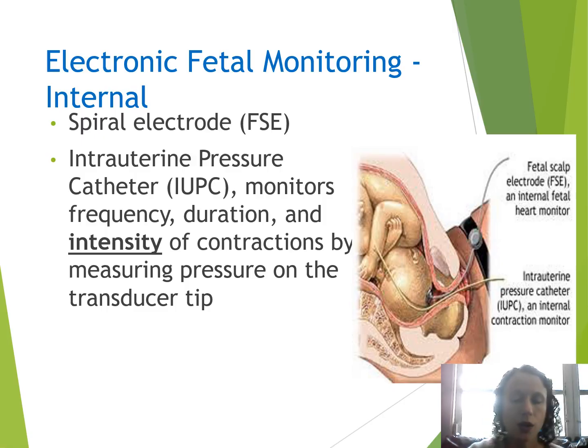That being said, it does not actually harm baby's head. You wouldn't want to put it over a fontanelle or anything along those lines, but it does not harm baby's head. It actually goes on the presenting part. So if your presenting part is a buttocks, it would go on that too.